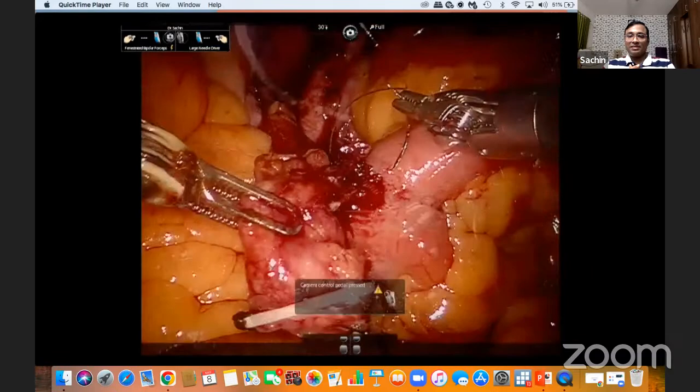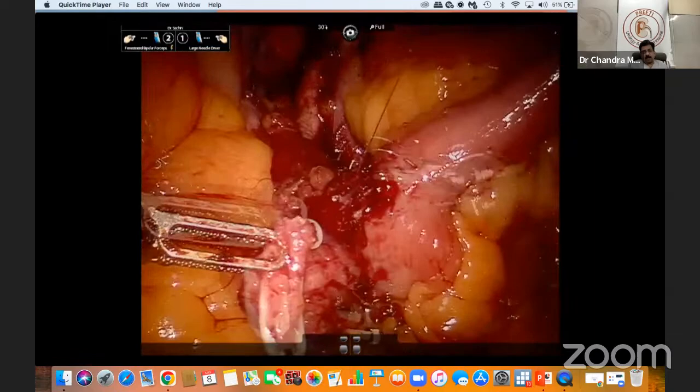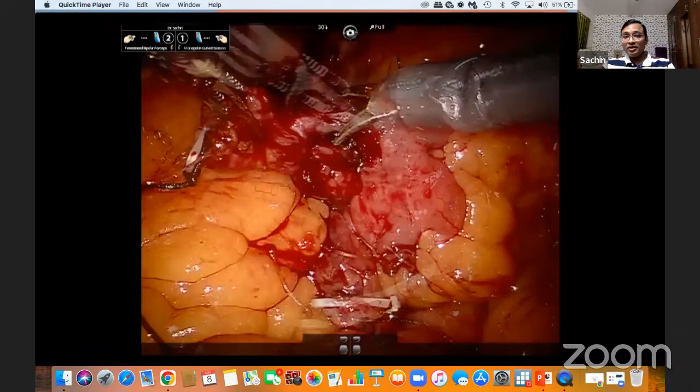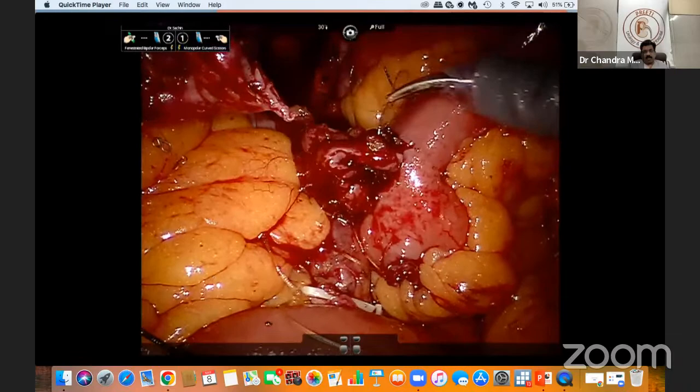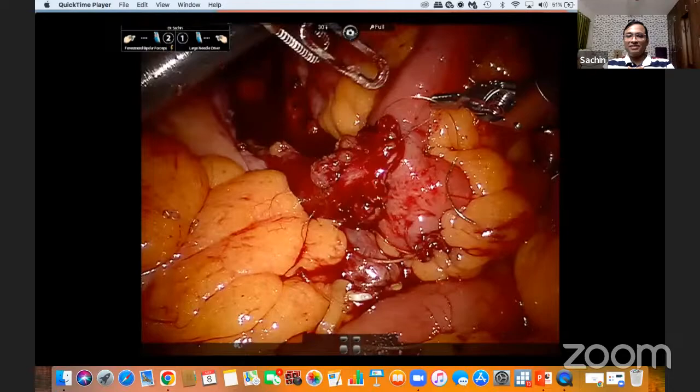At the end, you leave the ureter or you just cut it and suture? I didn't get what's the question? At the end of the ureter, I'm going to cut it off. It's not required. In open surgery, you need this because you'll be suturing the anterior wall. Most of the time, you sacrifice. Exactly. I also do it laparoscopically. Very, very useful this is. Makes life very, very easy. Also this ureter was very dilated. It made my life easier.